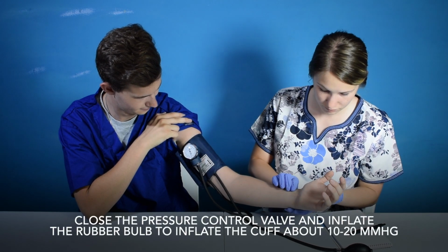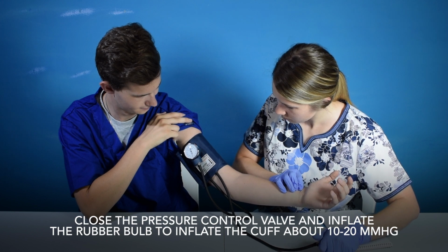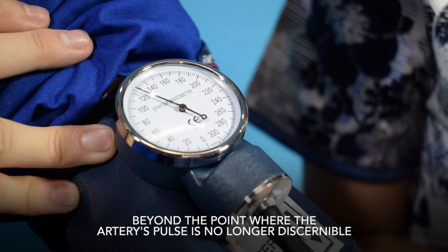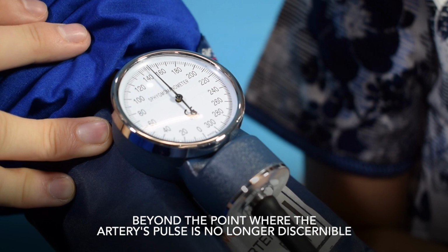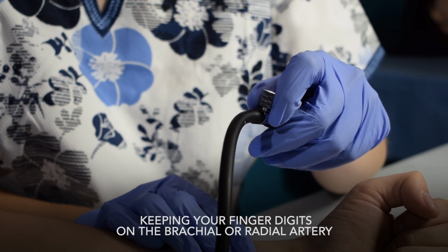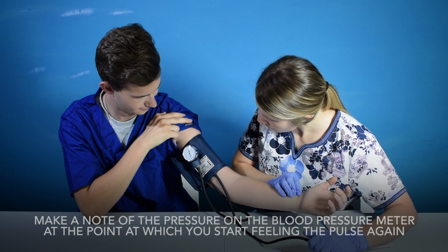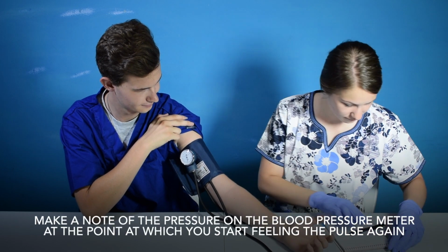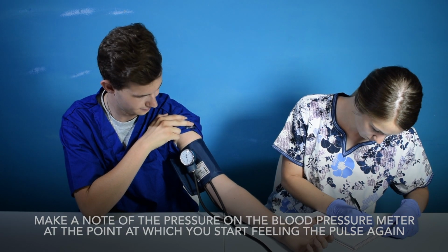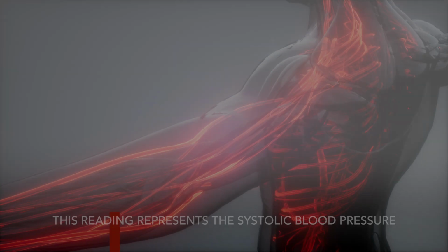Close the pressure control valve and inflate the rubber bulb to inflate the cuff about 10 to 20 millimeters mercury beyond the point where the artery's pulse is no longer discernible. Gradually release the pressure by opening the pressure control valve slowly, keeping your finger digits on the brachial or radial artery. Make a note of the pressure on the blood pressure meter at the point at which you start feeling the pulse again. This reading represents the systolic blood pressure.